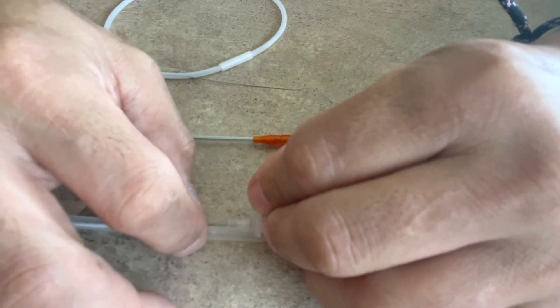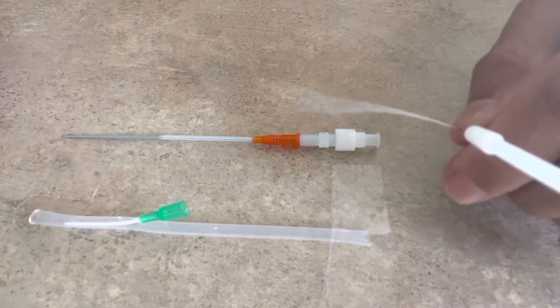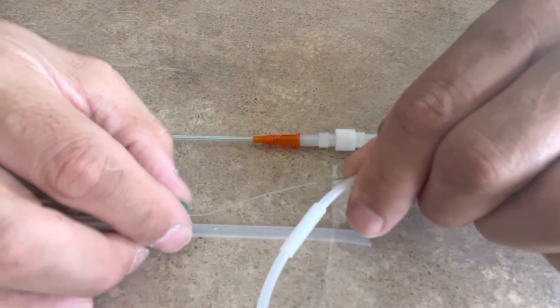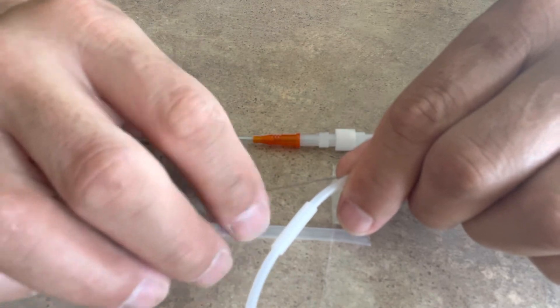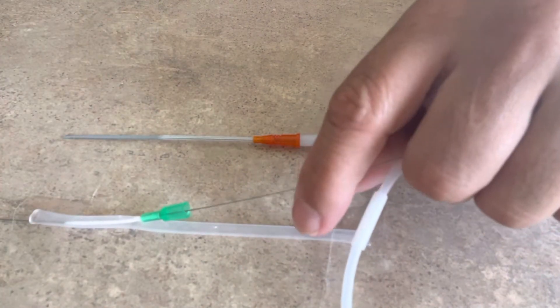And then we're going to use a Seldinger technique, where we're going to take a wire, this 0.018 wire, and we're going to introduce it into the angiocatheter itself. And then we're just going to wire this, rewire this angiocatheter.